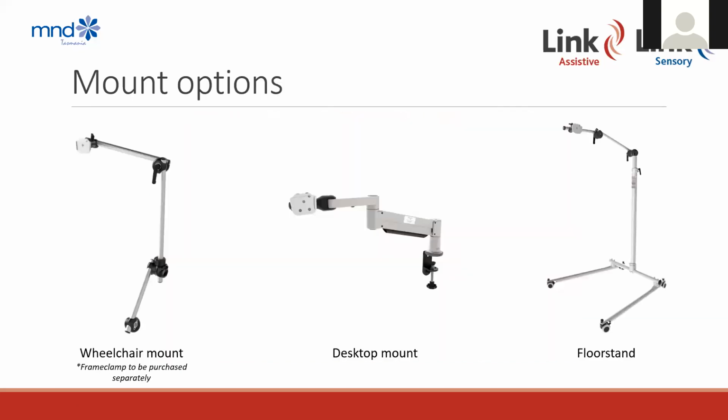Okay, so yeah, that was all access options. That was, yeah, a big chunk of what we needed to talk about. Your final thing that you want to be thinking through is mounting options. So how are we going to position the device, as I said, so that somebody is easily and comfortably able to access it across all of their different environments?